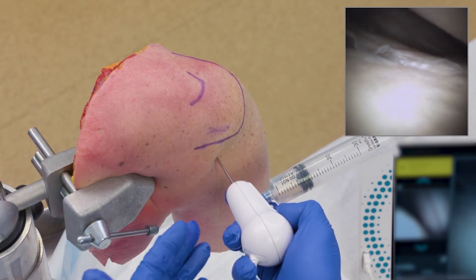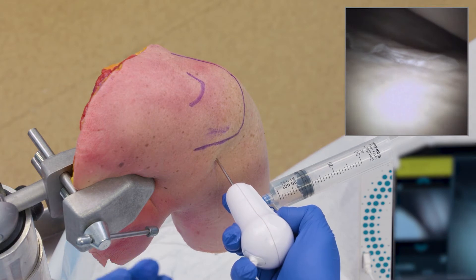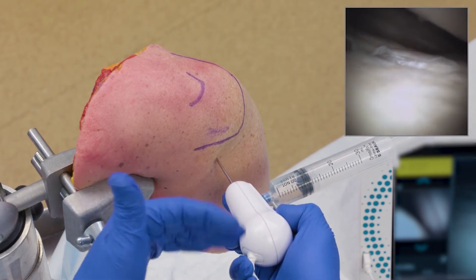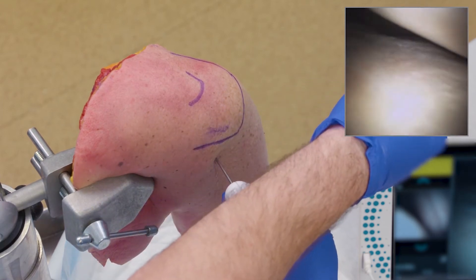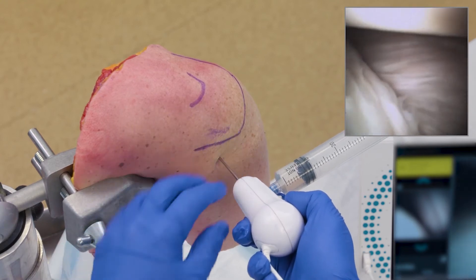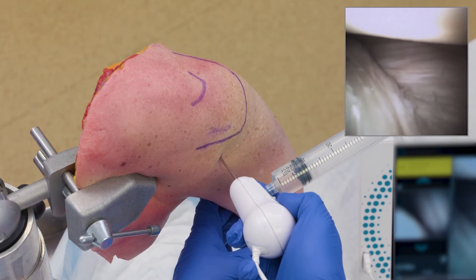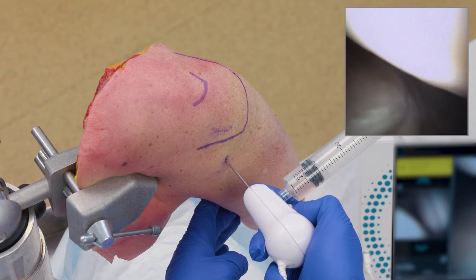This is a zero-degree scope, so just by turning my hand 90 degrees to the right, I'm now in my mind's eye seeing a lateral position. I'm down here at the Bankart area where the tissue would tear for shoulder dislocation. I can look at that cartilage and make it flutter by giving a little flush. I can retract underneath the humeral head and see my axillary recess and my pouch — make sure there's no loose bodies. Just putting the arm out to 15 degrees lets me get underneath there.